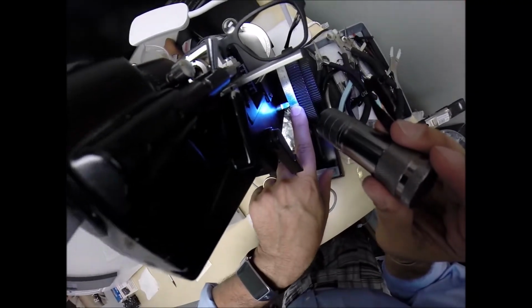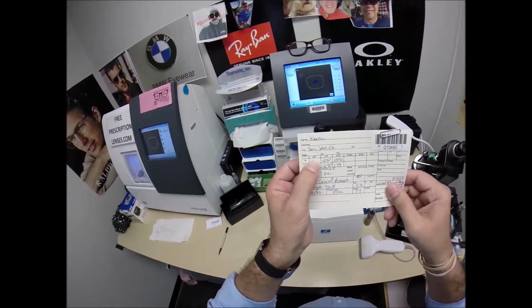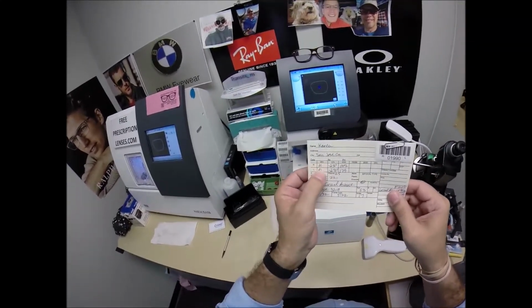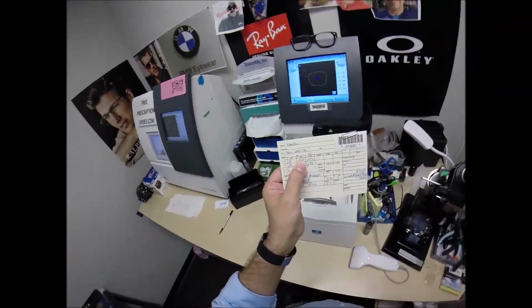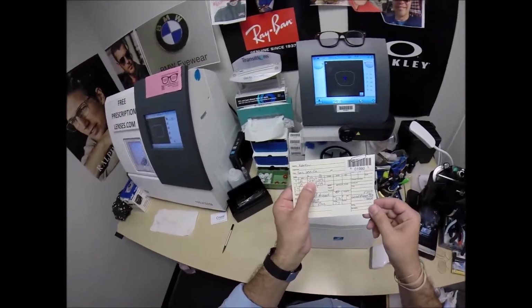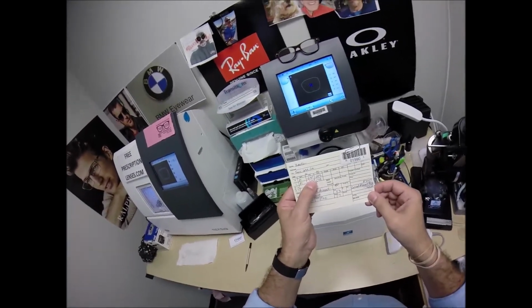I'm still on 0, no power, because your prescription reads plano, which means no power in the left or right eye, but you do have 2.5 diopters of astigmatism. Uncorrected astigmatism makes 6s and 8s look alike, or the letters P and F. Think of it as the fine-tune knob, and that's actually while driving at night.